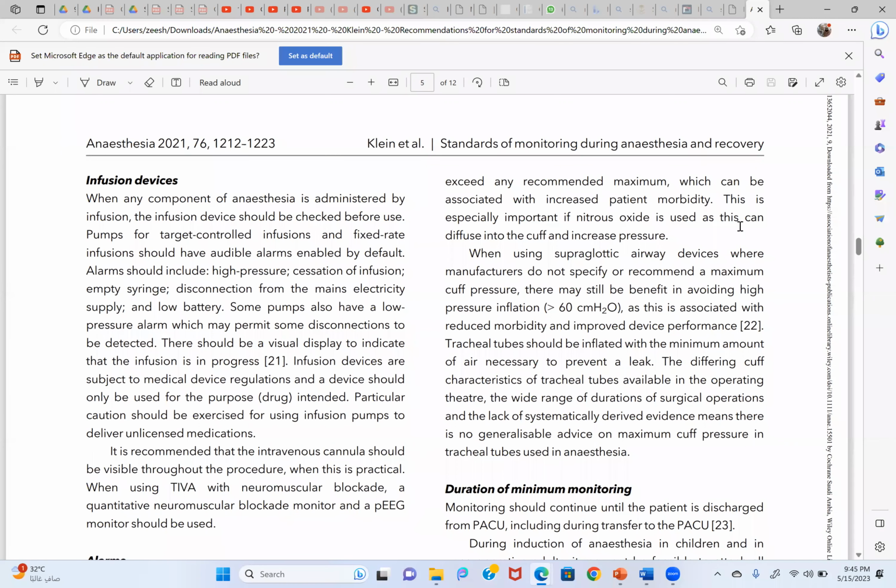Another important thing which I had missed is cuff pressures. Okay, if you are using increasing the flow to reflect the change in mac, Tayyaba, I will explain, just give me few minutes. uh, just a second, please mute the mic, it's a disturbance for me. Anyways, so this is very important.